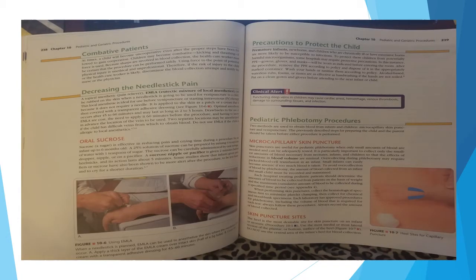Combative patients. At times, a child will become uncooperative even after the proper steps have been followed to gain cooperation. Children may become combative, kicking and thrashing if force is used. Because sharps are involved in blood collections, the healthcare worker must be certain that the procedure can be performed safely. Using force to the point of potential physical injury is unethical and unprofessional. Therefore, if the risk of injury to the child or the healthcare worker is likely, discontinue the blood collection attempt and notify the nurse and/or physician.